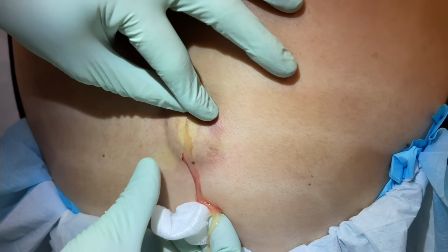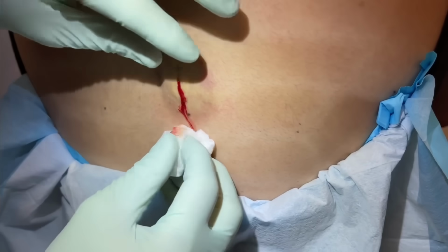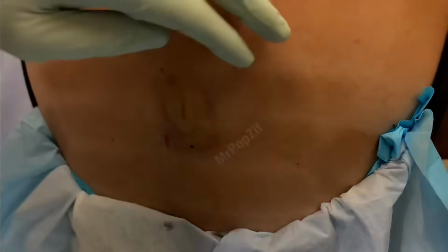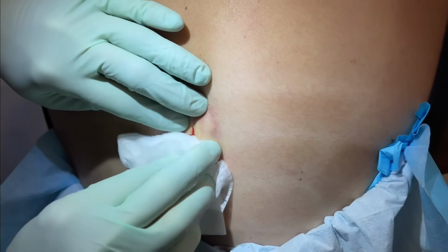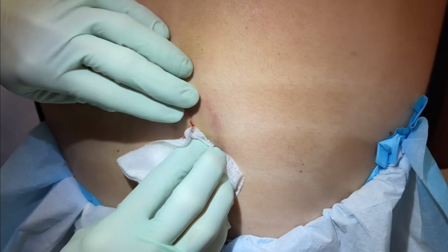Yeah, serous fluid. There you can see, that's a good example. Clear yellow, that's what we want to see. That is serous fluid. That's what the body does when we have a pocket there as it's healing. I know it looked like pus before. This could shoot out, so I'm going to cover that just a little. Good. Yeah, there's not a ton in there.